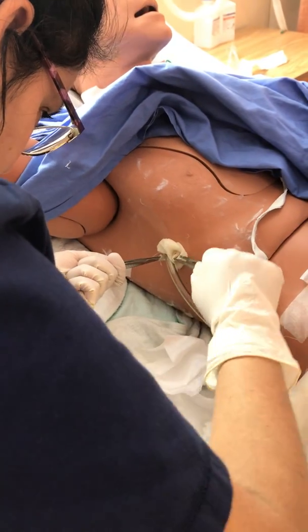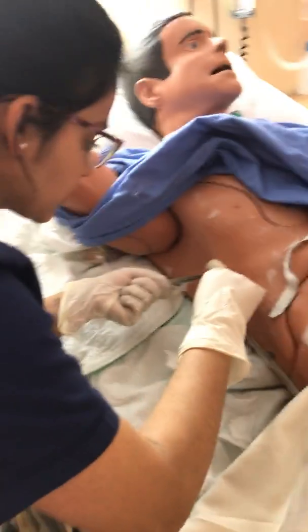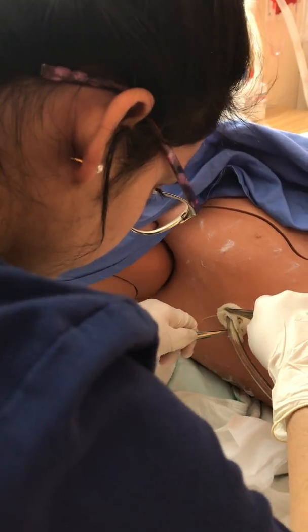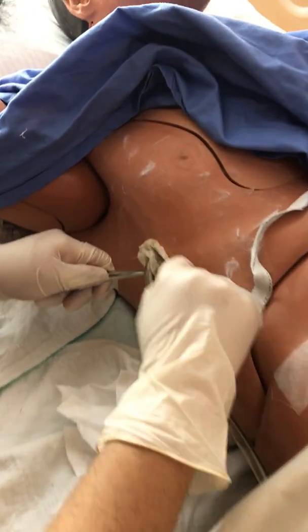So it's correctly transcribed. So you want to make sure, even though the forceps is touching the outer, we already cleaned it. So it's all good. Clean. So I can see that it's fentanyl, so 2 nurse check. And it's going to be given by a student nurse, so I can give that. So I'm going to look for the PCA preparation. So my doctor ordered 10.